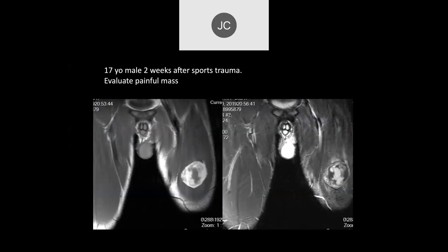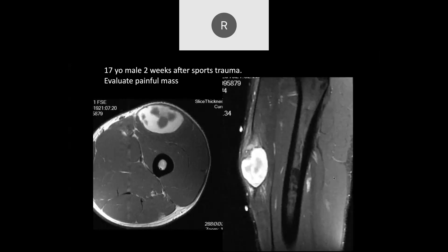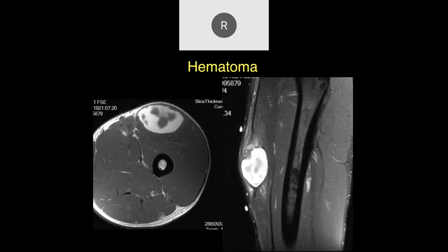We have a 17-year-old male, two weeks after sports trauma, evaluate painful mass. It looks like there's a heterogeneous collection anterior to the rectus femoris, or within the muscle itself. I'd be concerned about an intramuscular hematoma primarily.